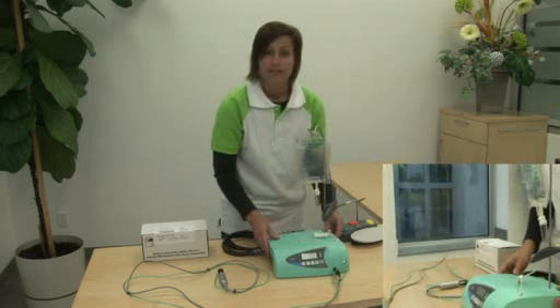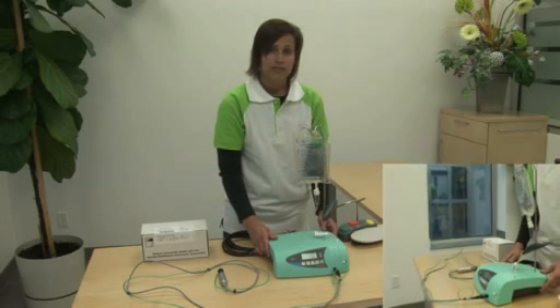That completes how to install your W&H standard irrigation tubing set.